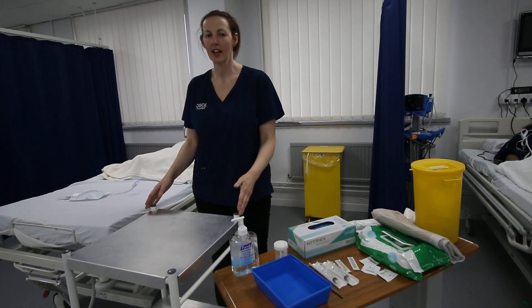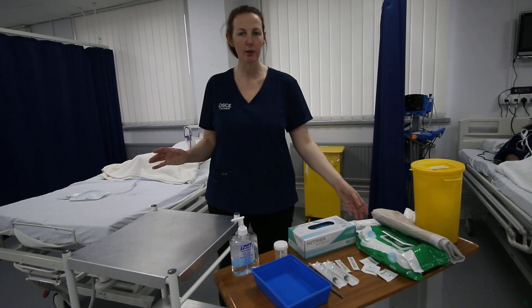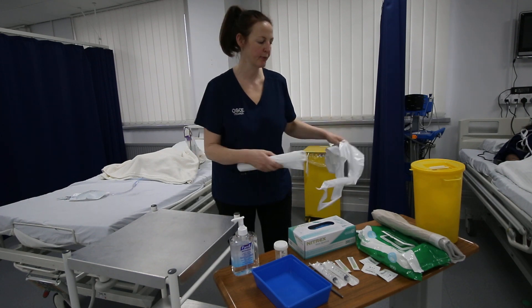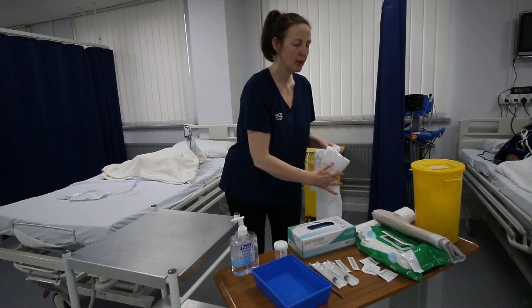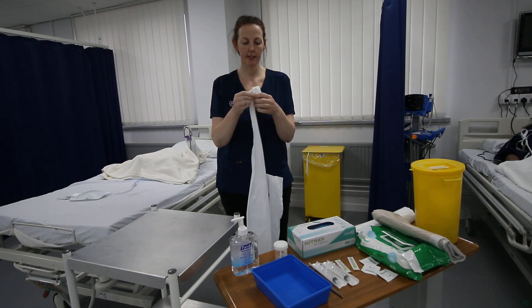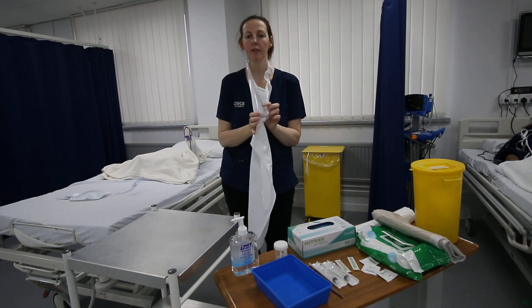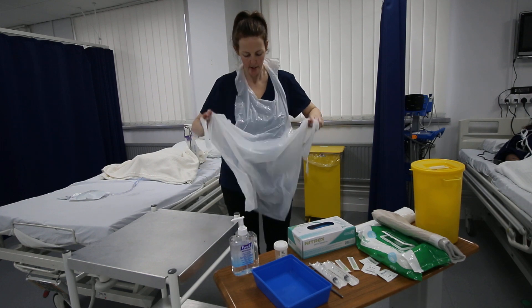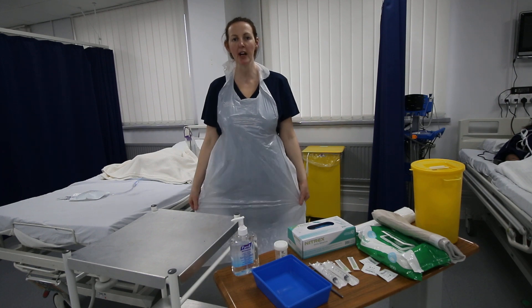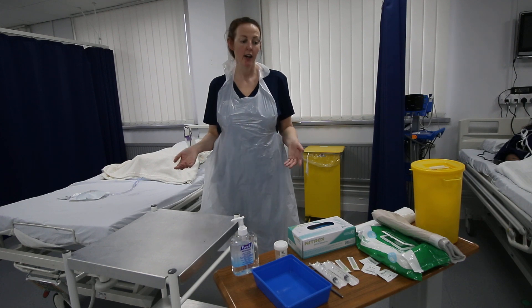Now I can start preparing all my clinical equipment. I'm going to presume that my trolley has been washed and cleaned with soap and water in the last 24 hours — is that right, examiner? Yes. So I can don an apron. In the NMC OSCE we need to show correct use of PPE. An apron prevents my patient getting contaminated from microbes from my uniform, and it also stops me coming into contact with bodily fluids which could spill during the procedure.